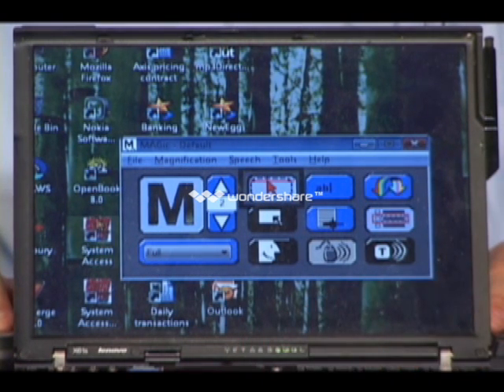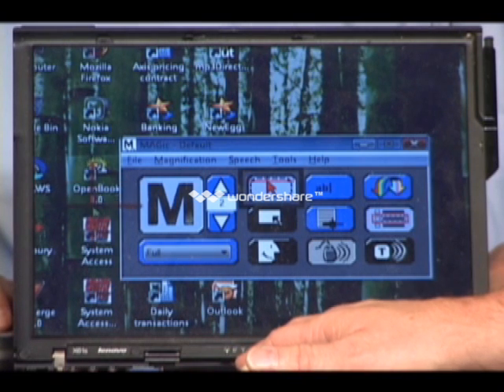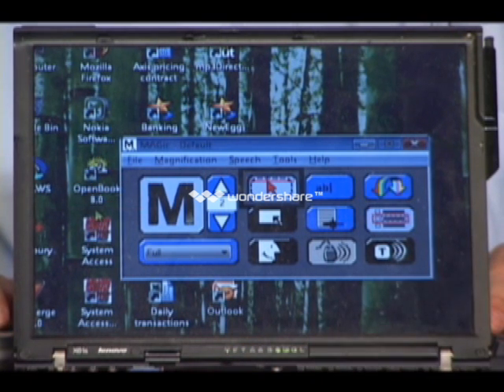We can change the mouse enhancements. We can set it to be an X. We can set it to be a large cross, so it takes the entire screen if we want. We can also have it visible all the time. Right now it's visible only when moving, which is what we found here. That's the default. We can change the cursor color, the mouse color, the cursor shape, a lot of things like that. Those things are all configurable. We can change the contrast. We can do different color combinations on the screen or different tints for different visual acuities.